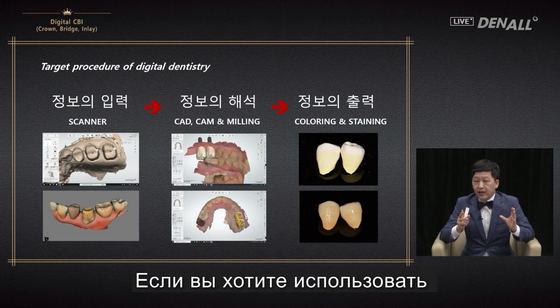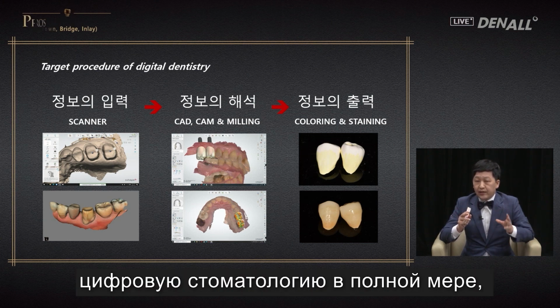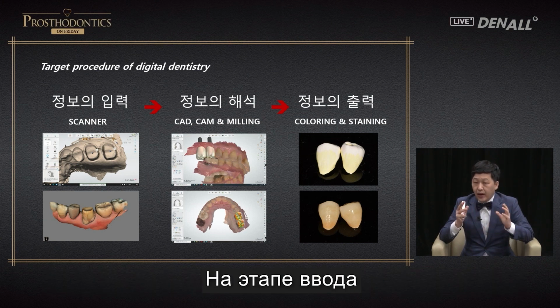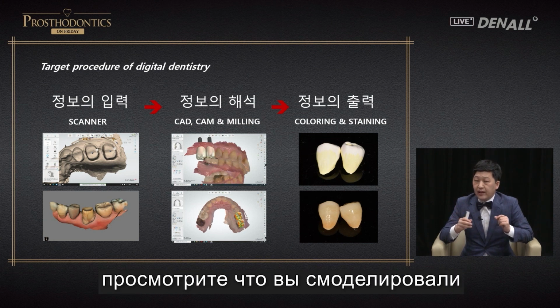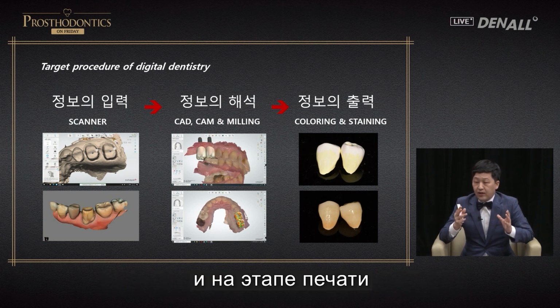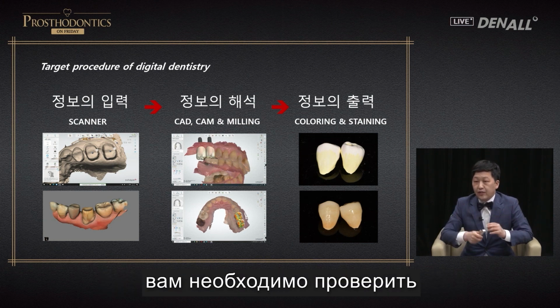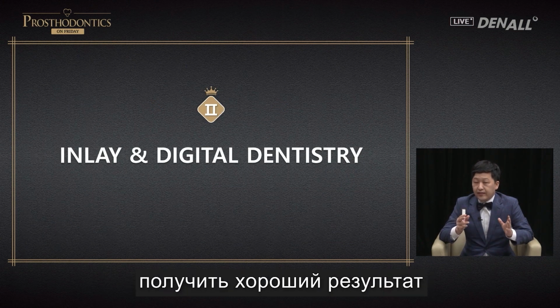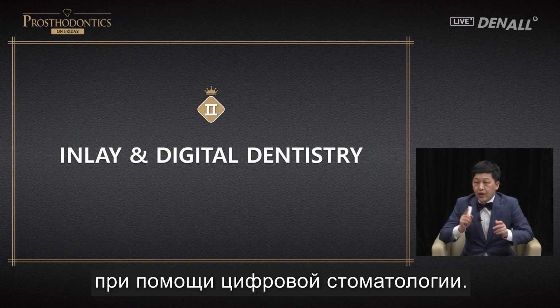If you want to utilize digital dentistry to the fullest, review what is done clinically. In the input stage and in the design stage, review what I have designed, and in the printing stage, you need to check whether accurate color has been achieved. By doing this, you can get good results using digital dentistry.